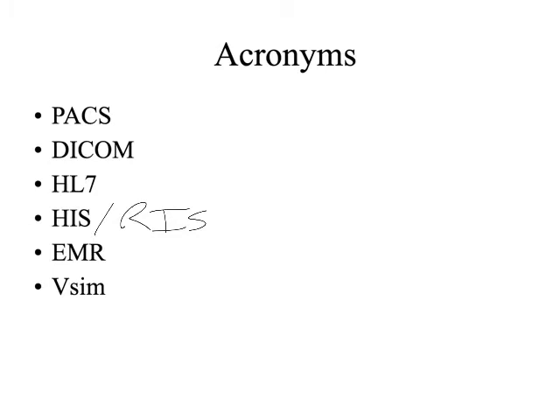So they've built different systems for these. So typically the health information system, the HIS, is for the nurses. The HIS is for the folks who are entering health information stuff like doctor's orders and stuff like that. The RIS is for the x-ray techs, and y'all also are using a RIS when you use ARIA.